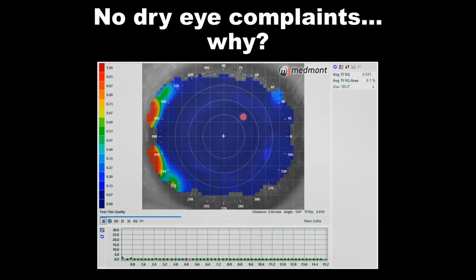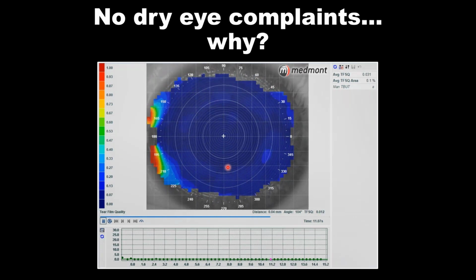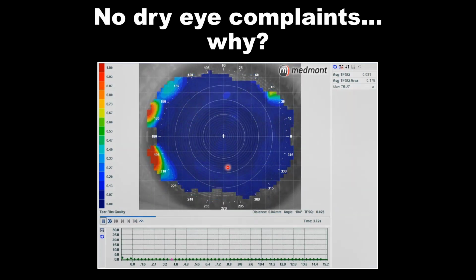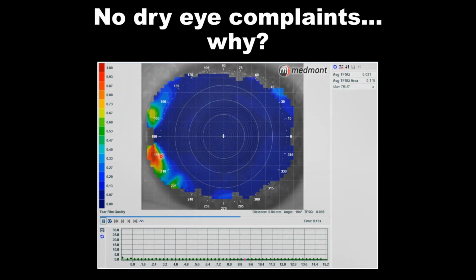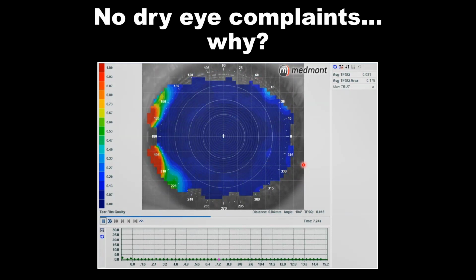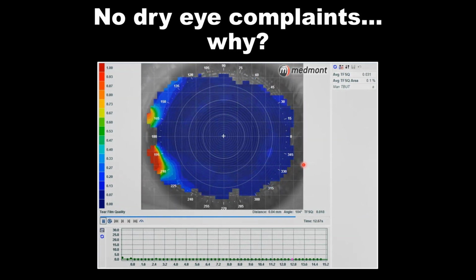The dark blue area is indicating to you from point to point on each one of those rings, the tear film really shows no elevation change. It's completely smooth from one point to the next. Where you see the red, that's where the points appear to have more elevation shift, and that's pretty normal for us to see toward the peripheral cornea. But the reason this patient is doing so well is they have an awesome tear film. This patient has an ideal surface tear film quality, and that's most likely why soft lens wear is really a non-issue.